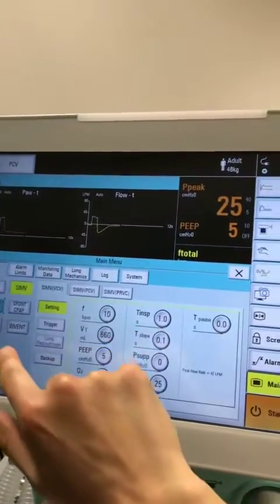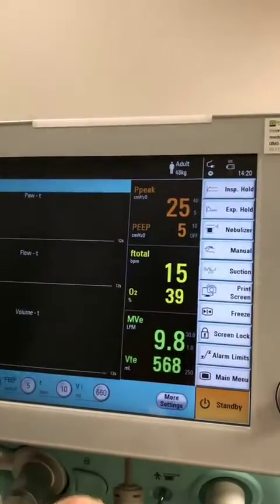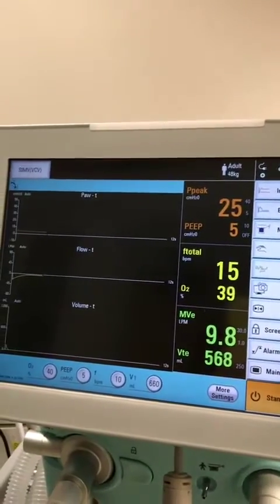And then here you can change your mode, press accept, and it will move you into a different mode.